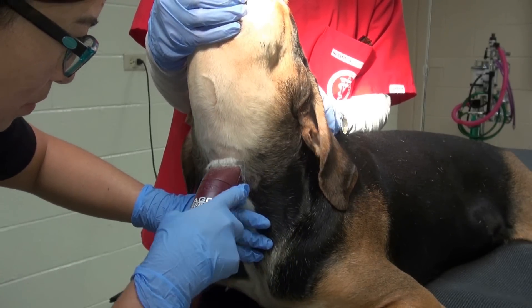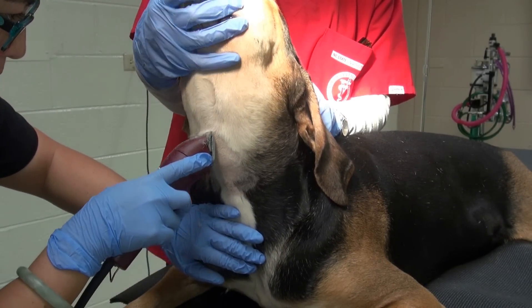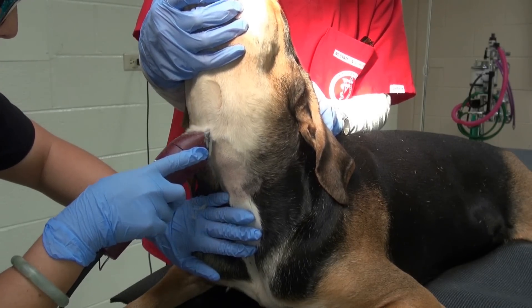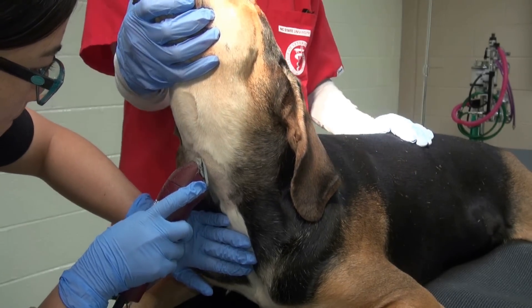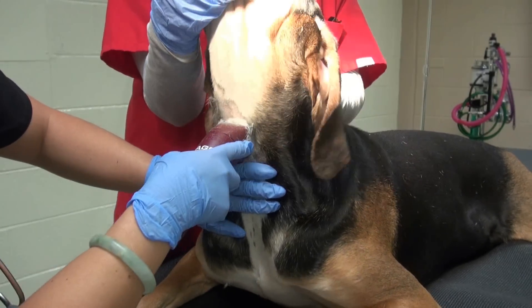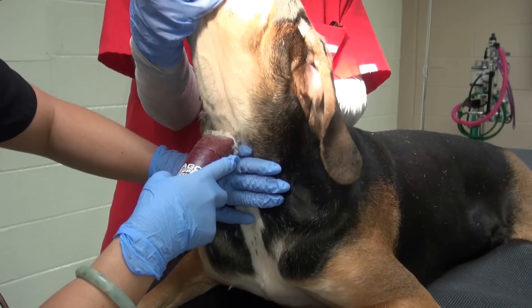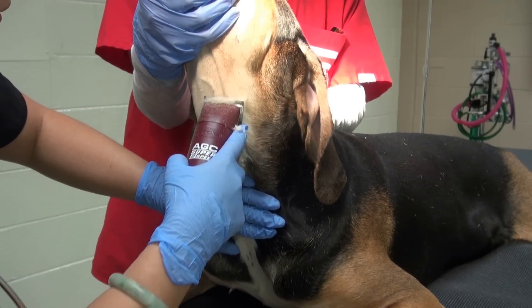Go as gently as you can and keep the blade as parallel to the skin as possible. You don't need to clip more than a circle of around 2 inches in diameter around the center of the cricoid cartilage, so if anything this clip is a little more generous than needed.